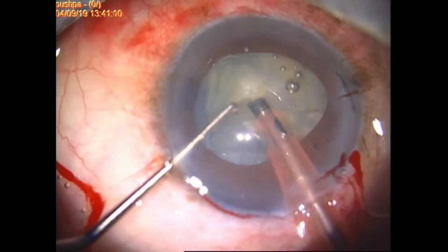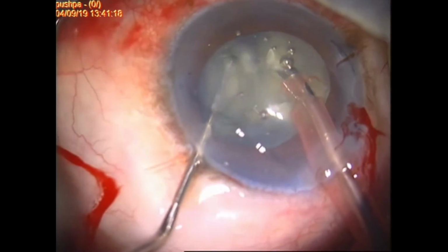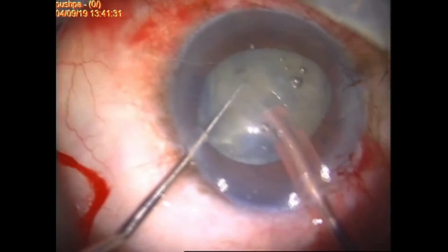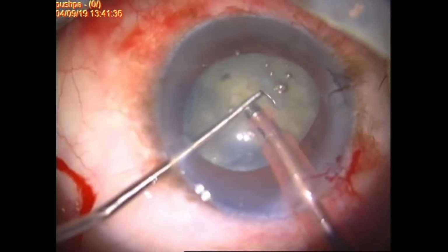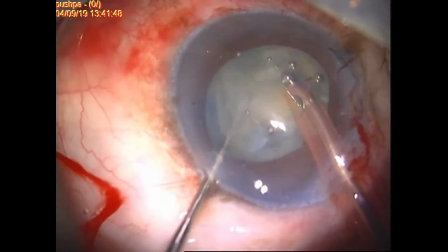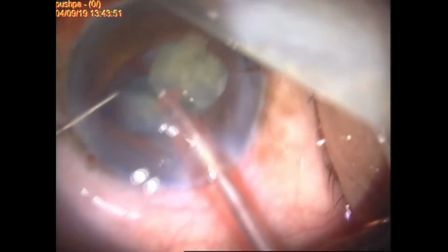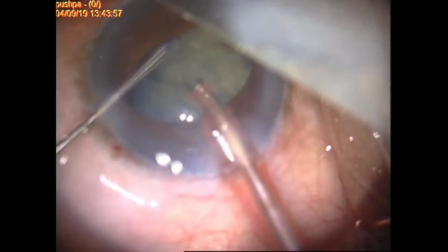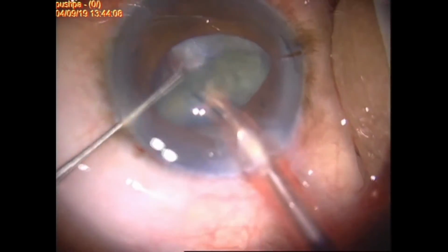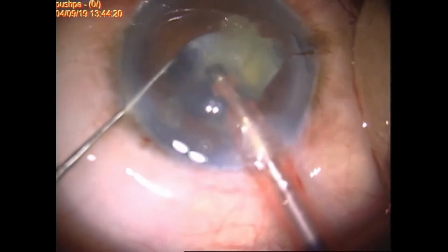This is a fast-forwarded video of stop and chop phaco with parameters comprising vacuum of 400 mm of mercury, aspiration flow rate of 26 ml per minute, and the bottle height was 80 cm. Nucleus management was done within the bag. Quadrant was also emulsified within the bag, with a few quadrants emulsified in the supracapsular plane. Quadrant removal was also managed meticulously with the reduction of phaco parameters.